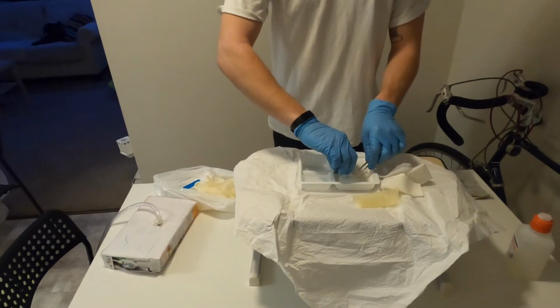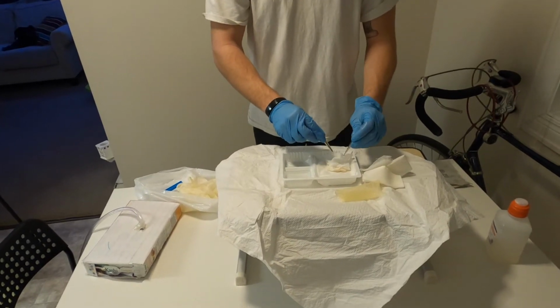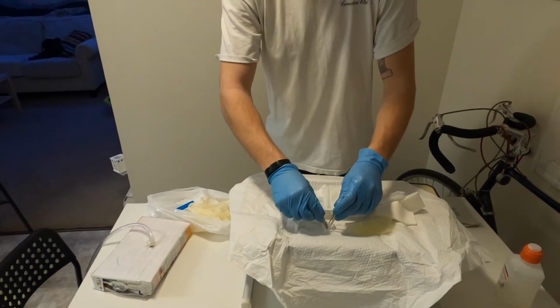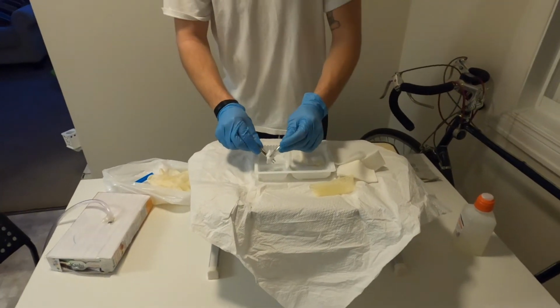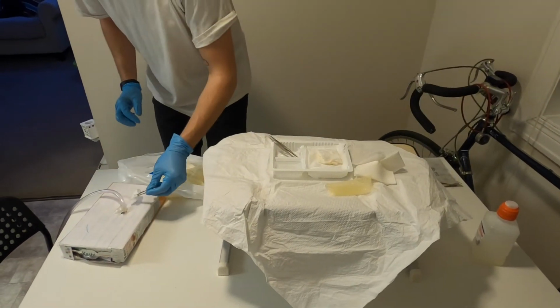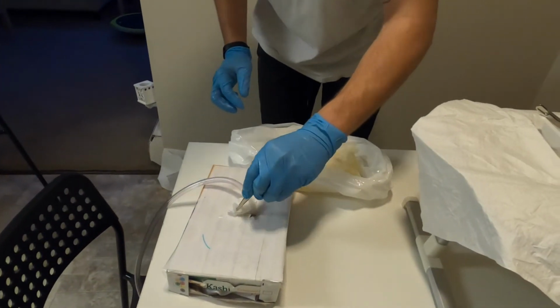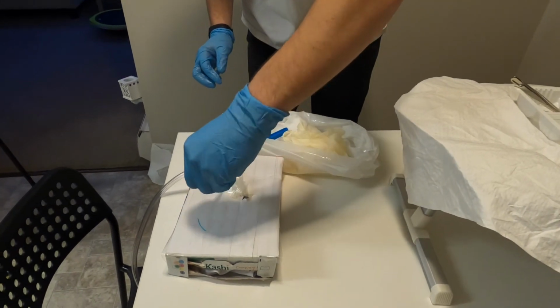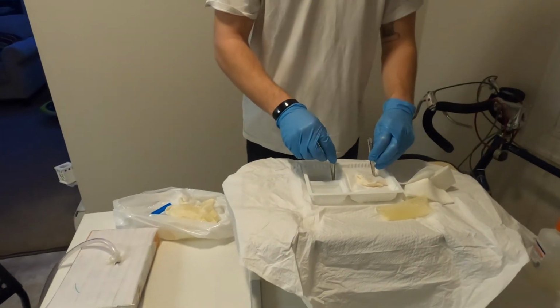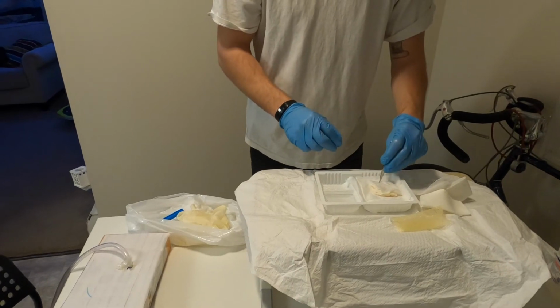So now I can go ahead and begin to clean. So I'm just going to use 2x2s here. To start. Some sterile water. Alright, so I'm going to go in a circular motion here, making sure not to touch the peri wound or the chest tube with the sterile forceps there. So there's one. So I dropped that. That's okay. I can actually keep working here.